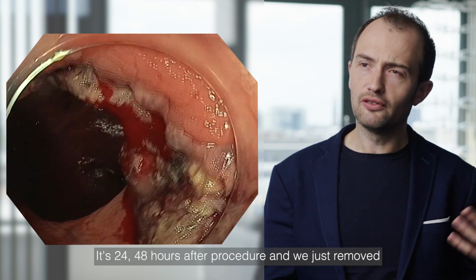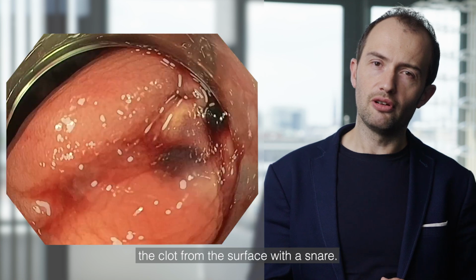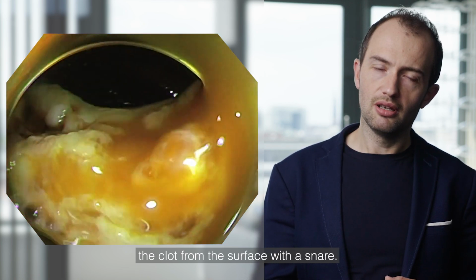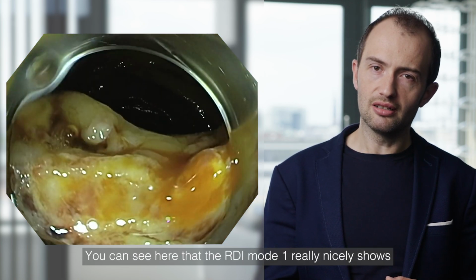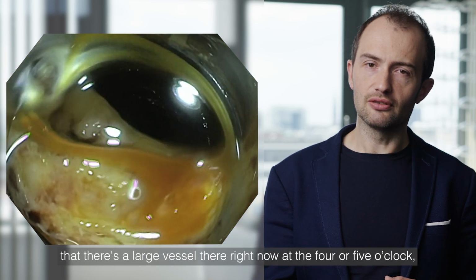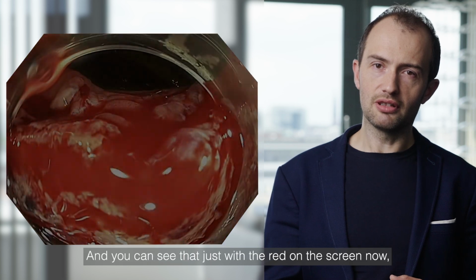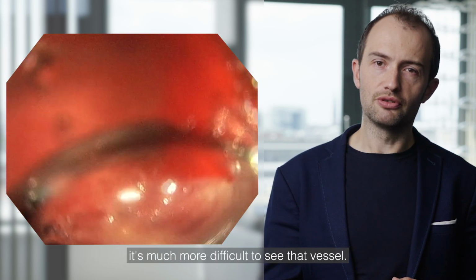The video that you see here is a polypectomy defect. It's 24-48 hours after procedure, and we've just removed the clot from the surface with a snare. You can see here that the RDI mode 1 really nicely shows that there's a large vessel there right now at the 4-5 o'clock, which is causing bleeding.